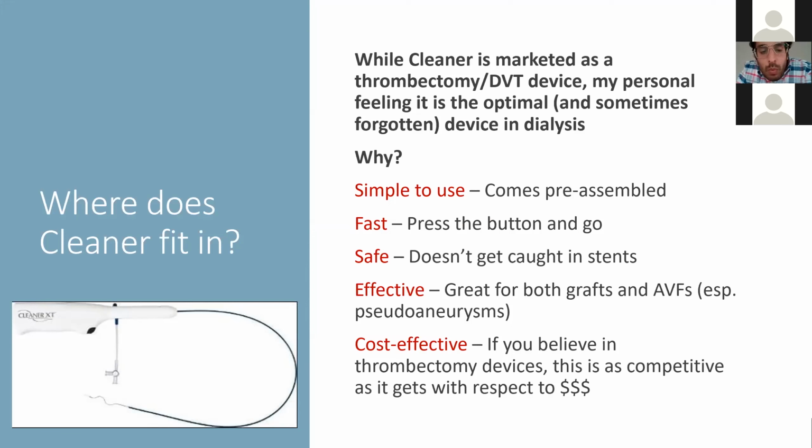Now with declots, I don't think that's relevant because, again, grafts have a small thrombus burden, and the vessels are just smaller. So you're getting a much more effective maceration. The clot is acute. If it wasn't acute, you wouldn't be even doing the declot to begin with. So it's a very long-winded answer, but I hope that makes sense to the person.